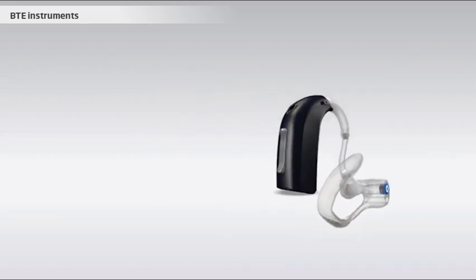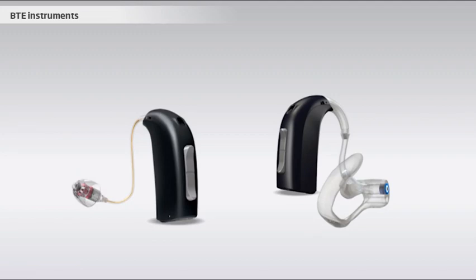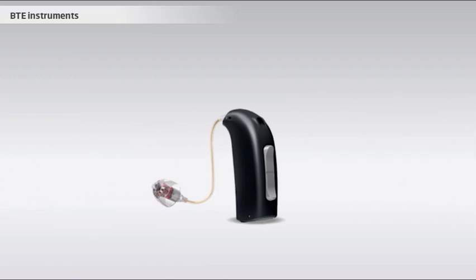The BTE models also come in a version where the receiver is moved outside the hearing instrument and into the earpiece. This means that the sound does not have to pass through the tube, but is delivered directly into the ear canal, just like in natural hearing. The solution is called receiver in the ear, or RITE. The RITE instruments usually give the best result for the user, due to the naturalness of the sound experience.